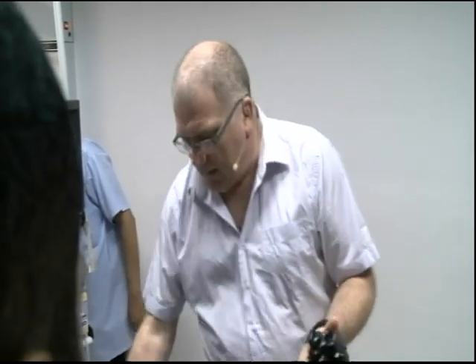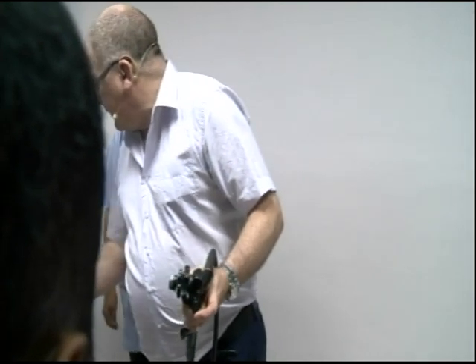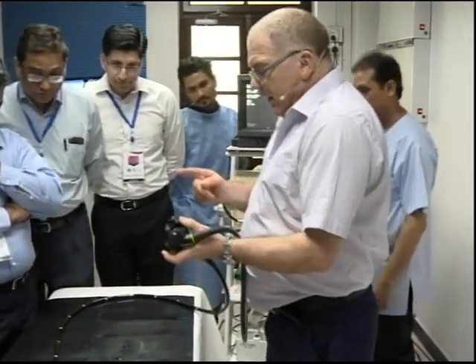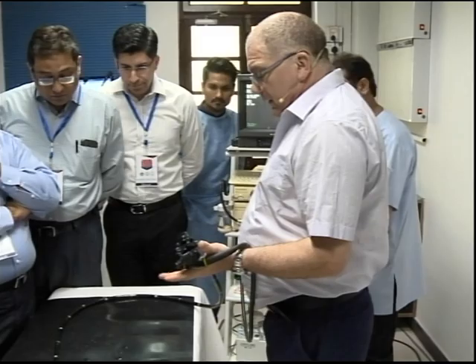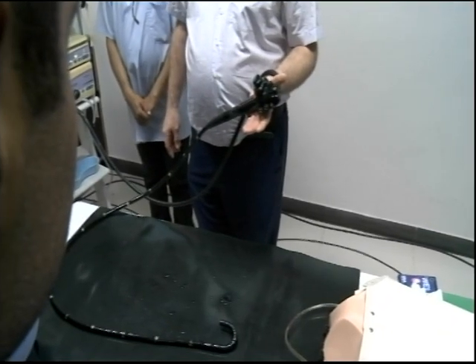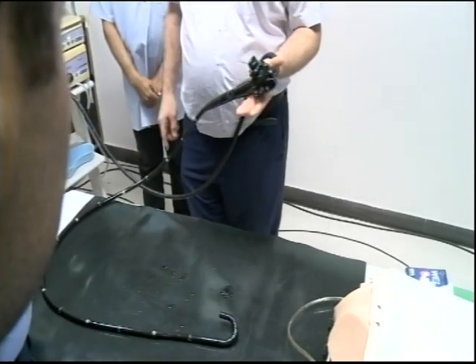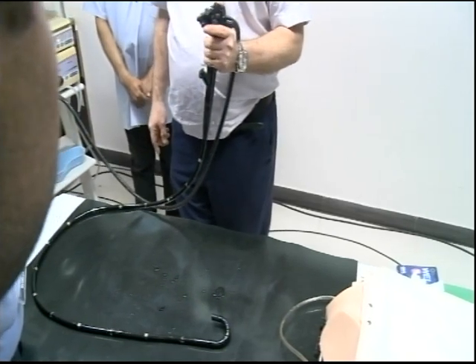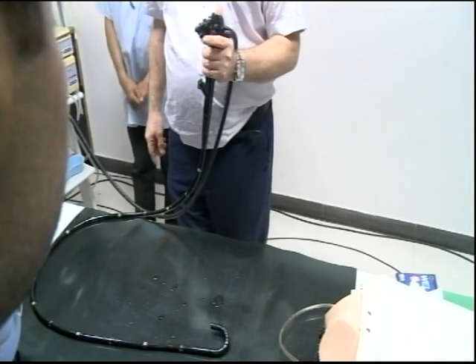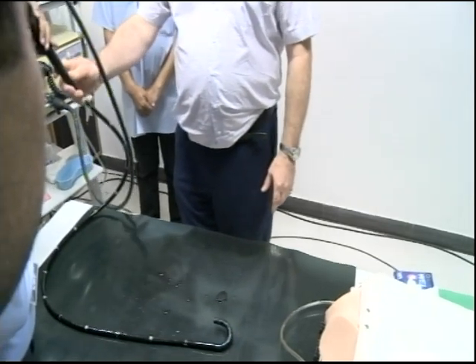I will talk about how we actually reduce loops shortly, but what we're going to talk about now is looking at the tip. I'm just going to take the image off, so we're looking at the tip. The reason I've put this on is so that you can see what the tip is doing. Right, so clockwise torque. How can I apply 360 degrees and make that scope go back to that position? What must I do? You hold the scope like this. How can I make that scope go 360 degrees?